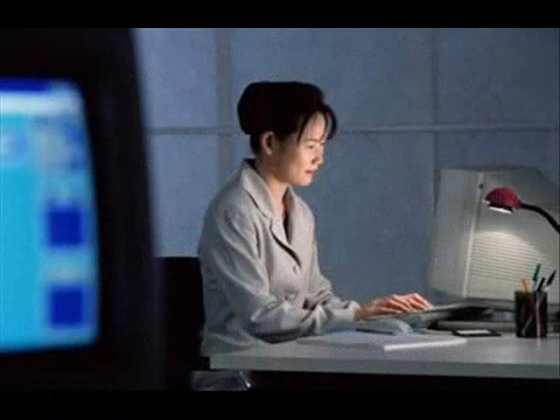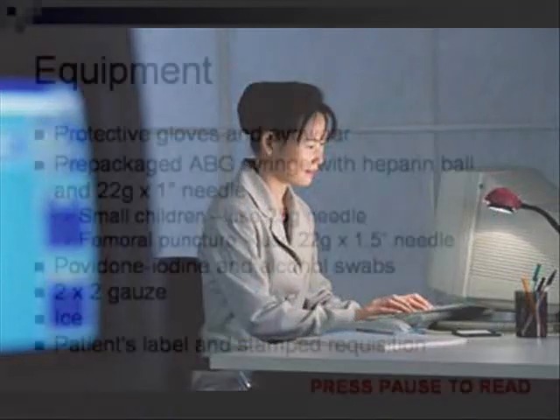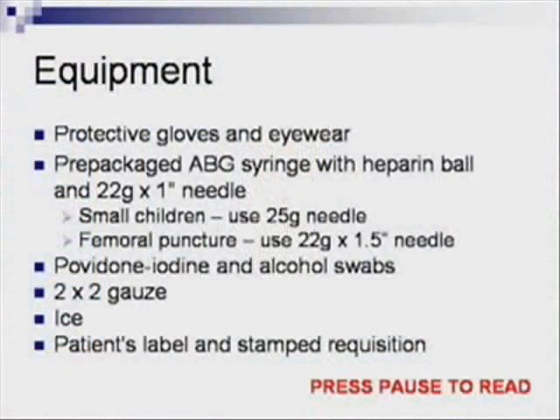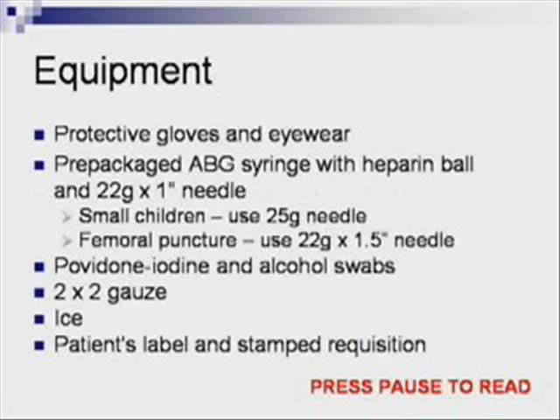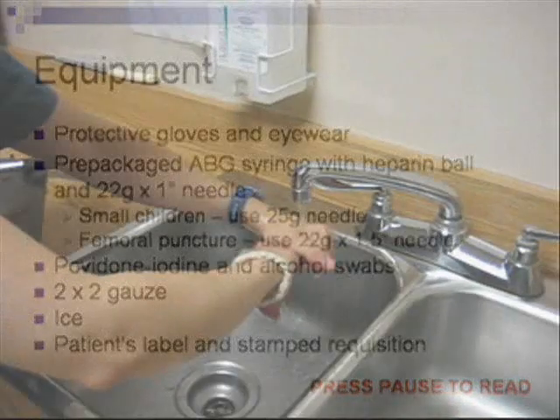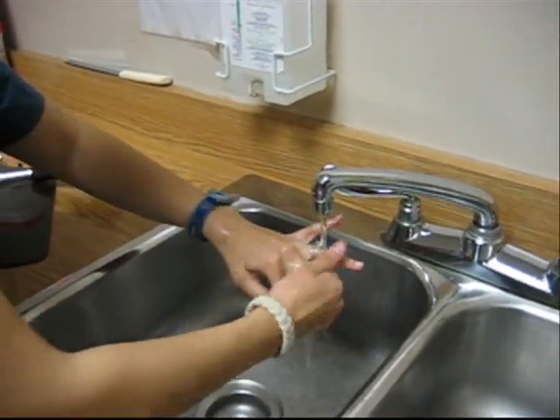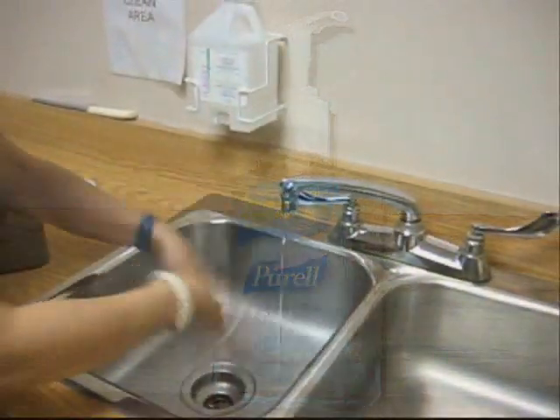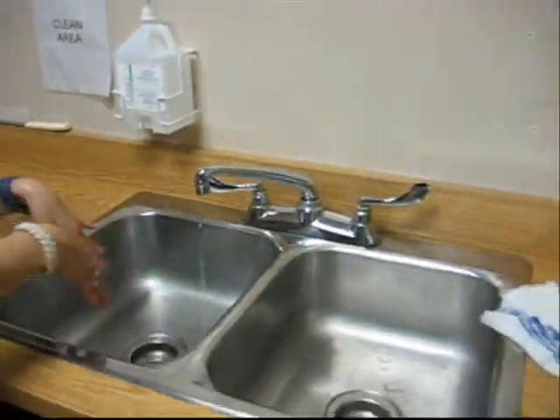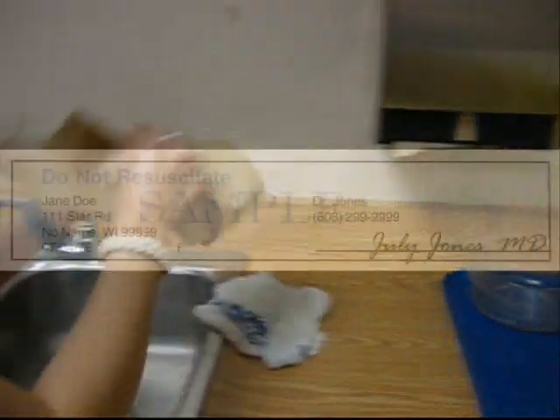Verify, interpret, and evaluate the physician's order. Select, gather, and assemble the appropriate equipment. Use aseptic technique throughout the procedure. Wash hands at a sink or with an approved alcohol-based product, and don gloves for all aspects of the procedure at the patient's bedside.